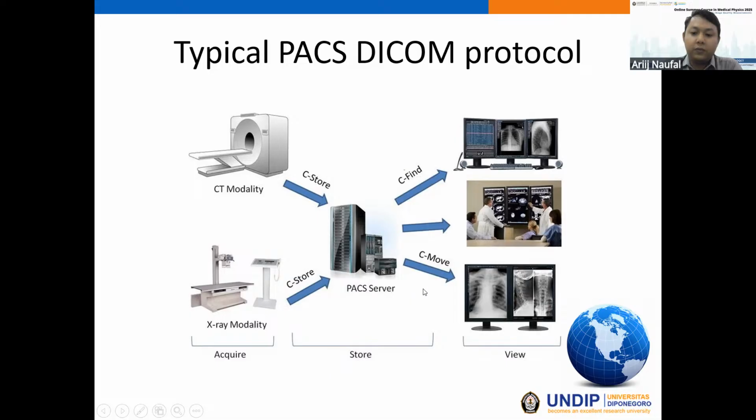And C-MOVE is a command to get the images from the server to an evaluation workstation. This is where mainly the doctor or the client can see the resulting images from the PACS.